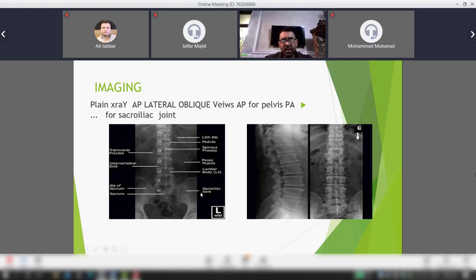If you notice the left picture and compare it with the right picture, you can see how it is different. First, look at the edges of the vertebra on each side. There is an osteophyte, which looks like a lip on the vertebra, like a ridge. What kind of ridge? This means osteophyte. And we look at the intervertebral disc space, you can see there is irregularity over the level of the vertebrae, while the left one is beautifully equalized.